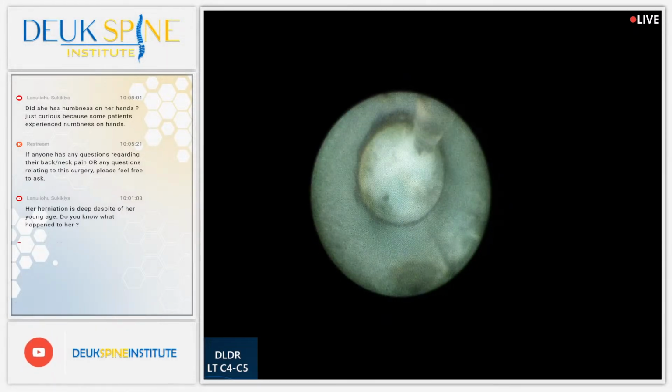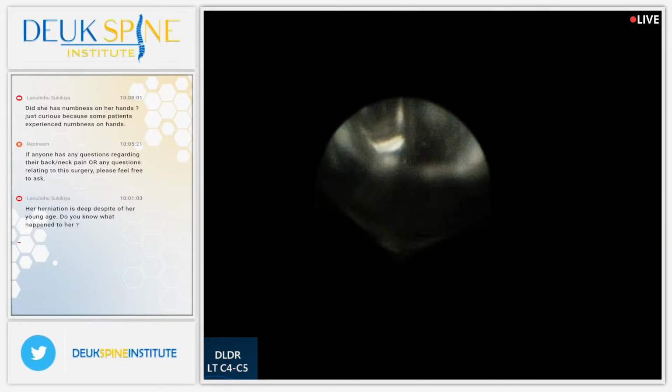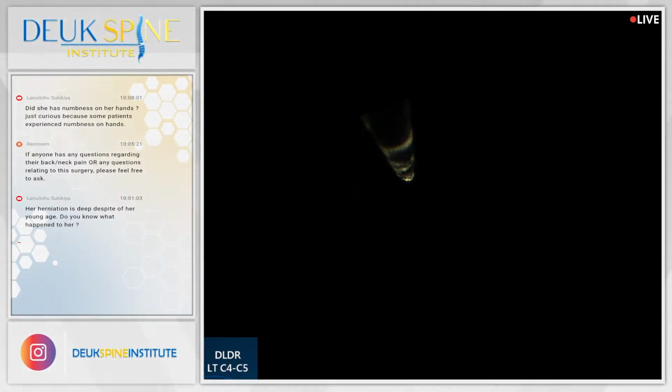Why is the irrigation changing so quickly? Oh, so you feel one level small bag. I see. All right. Yeah, we are saving the big bags. Yes. All right. So I couldn't grab it out. I may have to just break it up into smaller pieces.